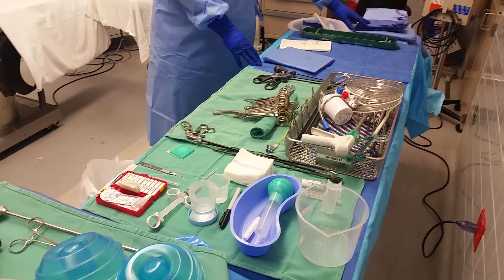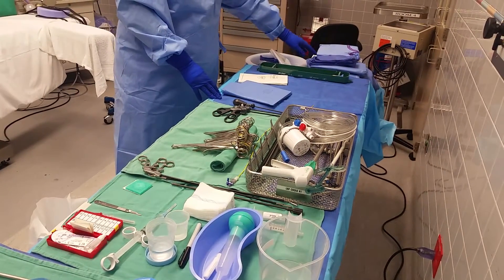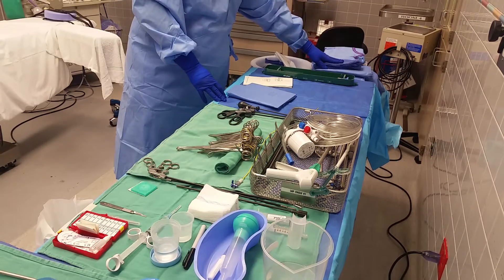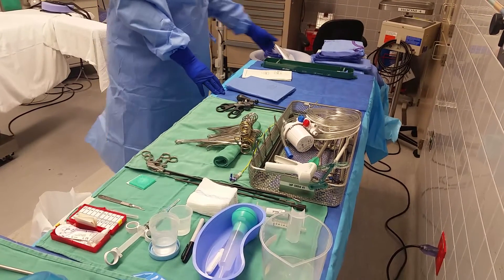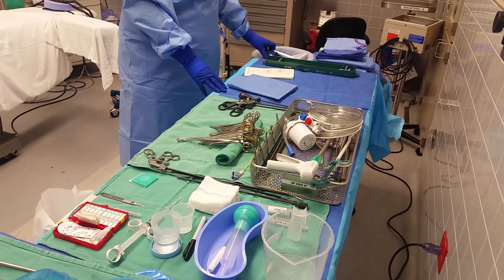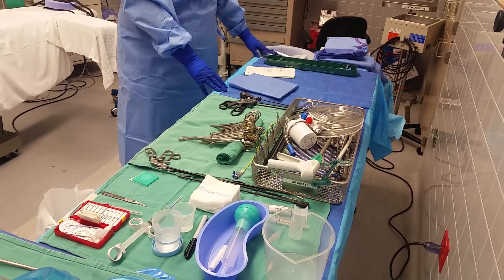And always here, I have my drapes, and I always set up in order. I always go doctor's gown, his gloves, and the ties he's going to use to drape. And on the side, we have your C-arm drape, extra ties if you need it, and if he has to open — your section three supplies.